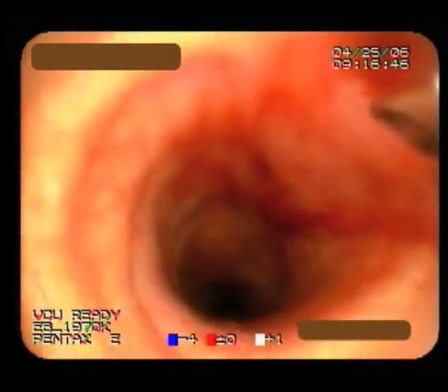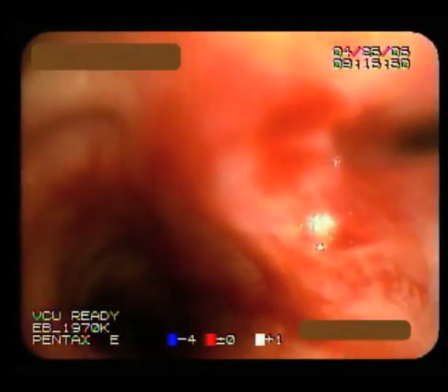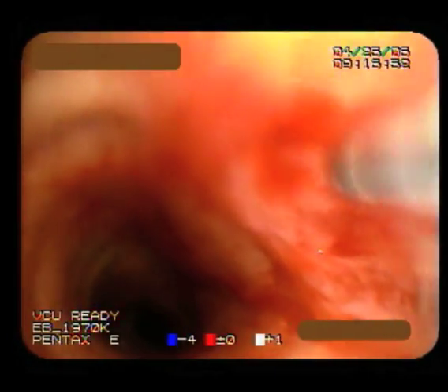Coming down medial to the main carina, and then pushing against the mucosal lesion. I see a nice entry into the mucosa here, and I'm just agitating with suction.